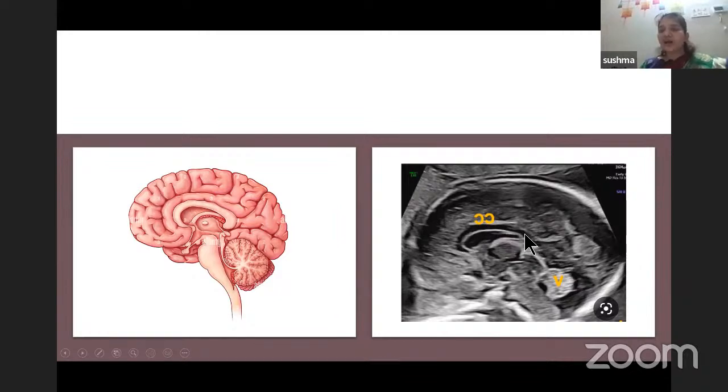How do we detect agenesis of corpus callosum through axial planes? By looking at the CSP. That's the reason we have given a lot of importance to CSP in all the three axial planes. We kept on repeating to take CSP in all the planes because CSP is a surrogate marker of corpus callosum. In cases of agenesis of corpus callosum, CSP is absent. So that is how, though we do not take the mid-sagittal section, we diagnose agenesis of corpus callosum on a regular axial plane.